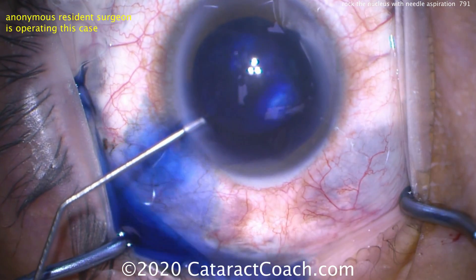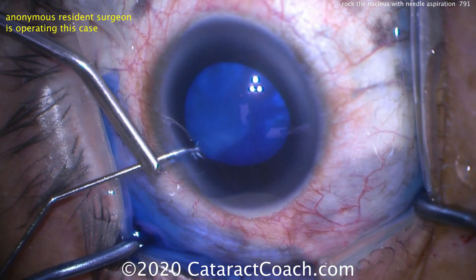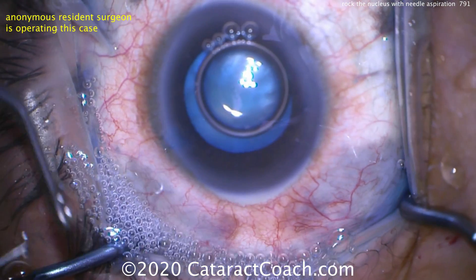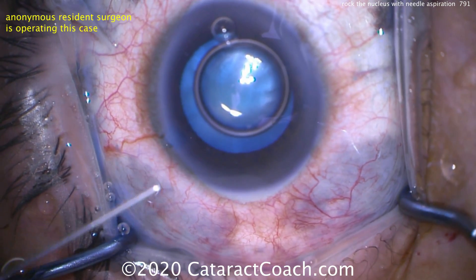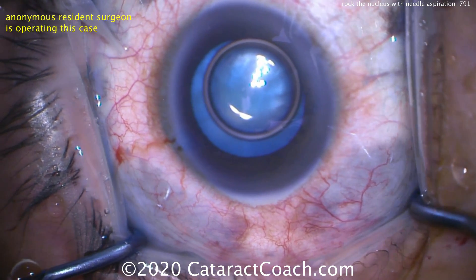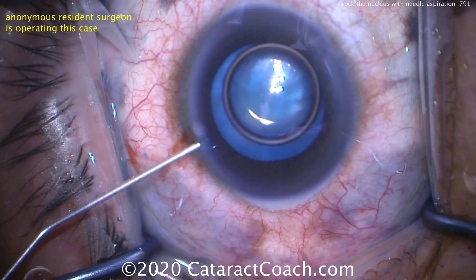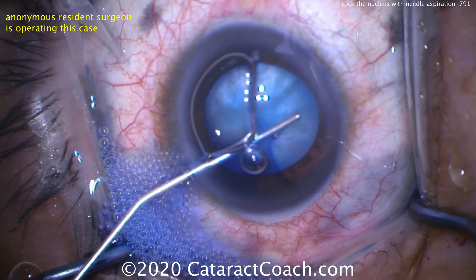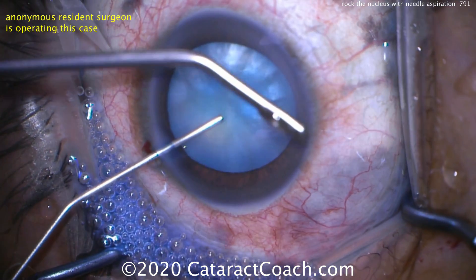We'll put in a Trypan Blue dye stain right here. Diluting the stain now with our anesthetic injection. Then we're going to get a good fill of viscoelastic — a dispersive viscoelastic to really fill up the anterior chamber and pressurize it. We want the pressure in the AC to be a little higher than the pressure within the capsular bag. That's going to help prevent capsular runout and that dreaded Argentinian flag sign. We want to aim for a pressure of at least 30 millimeters mercury.